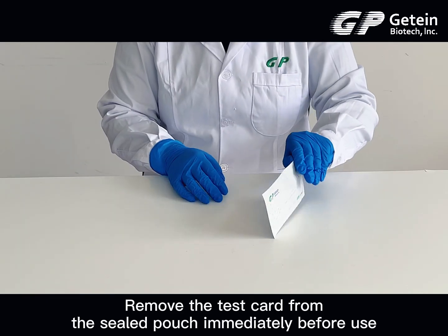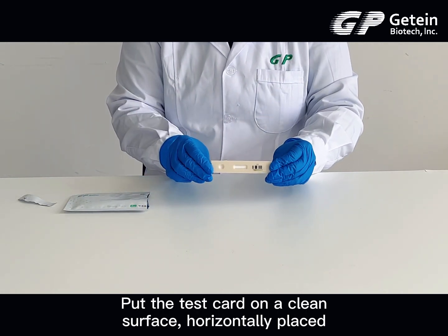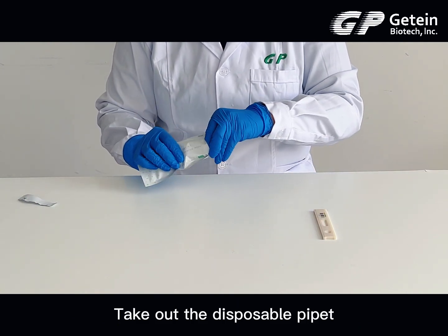Remove the test card from the sealed pouch immediately before use. Put the test card on a clean surface, horizontally placed. Take out the disposable pipette.